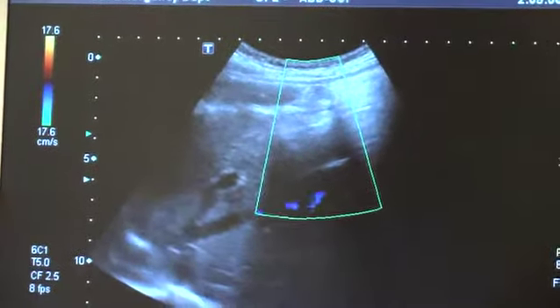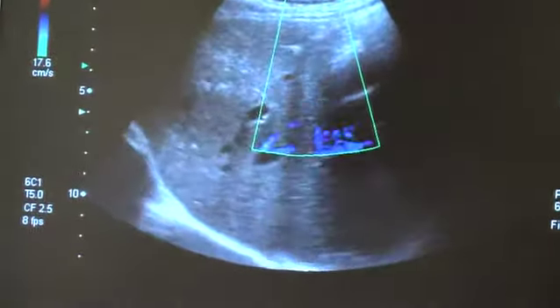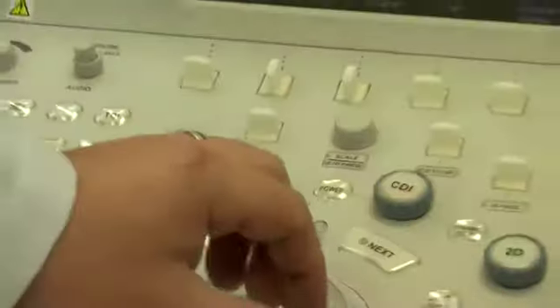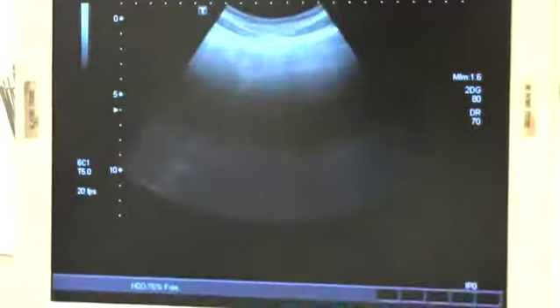The next form of Doppler is called pulse wave Doppler, PW. And what that does is that brings up a set of gates that you can put over. Pardon me. Alright. Look at my CBD, that's pretty cool.